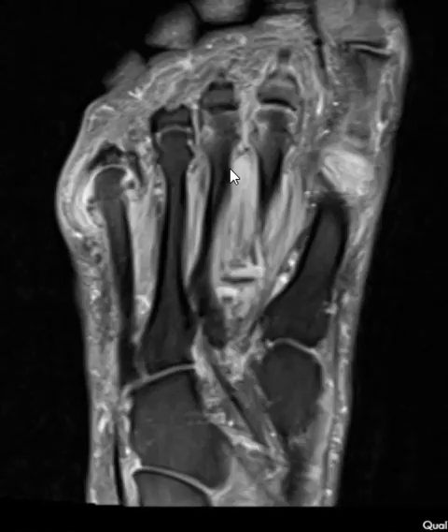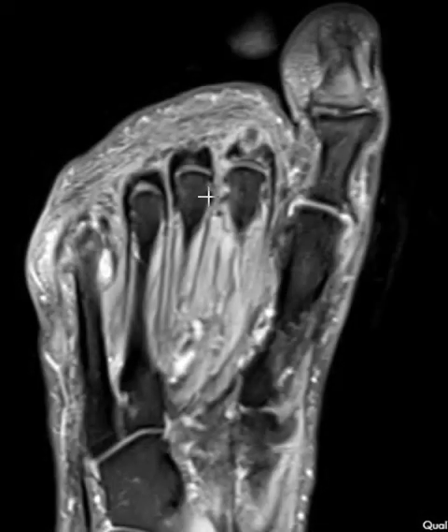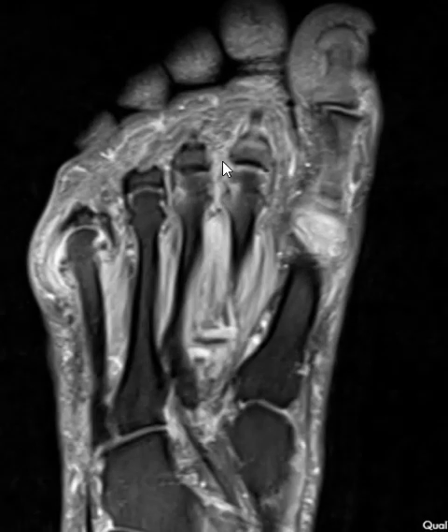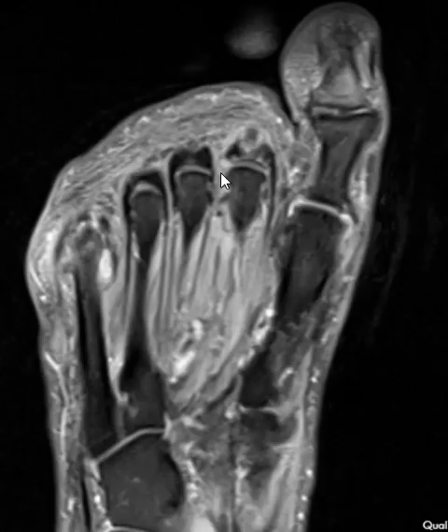The reason I'm showing this is for the plantar plate — it looks like they may have a plantar plate tear. They also have some perineural inflammation and edema here between the second and third metatarsal phalangeal joints. It is not normal to have this bright signal here; when we see that, we think about a Morton's neuroma or perineural inflammation, and we also think about a plantar plate tear.